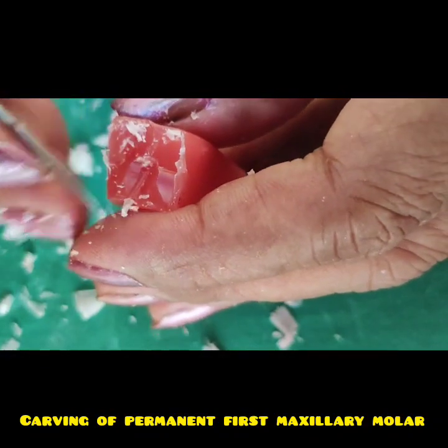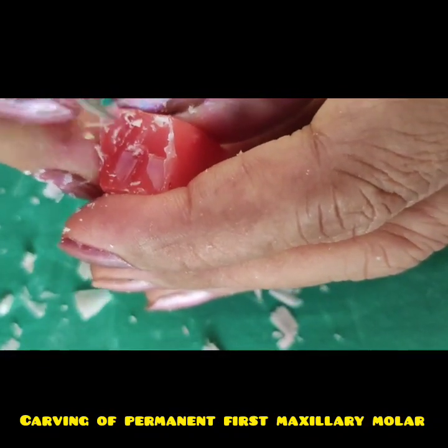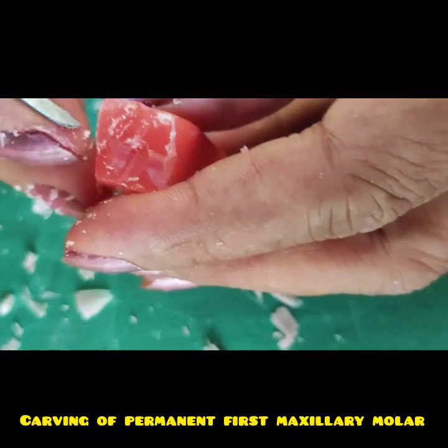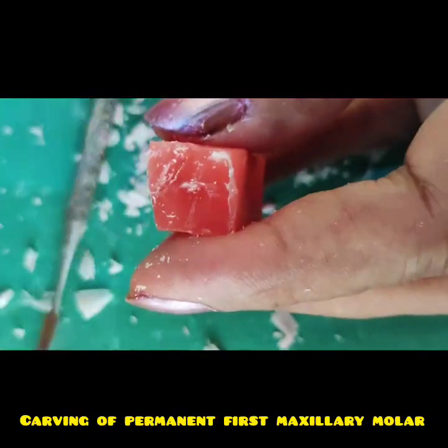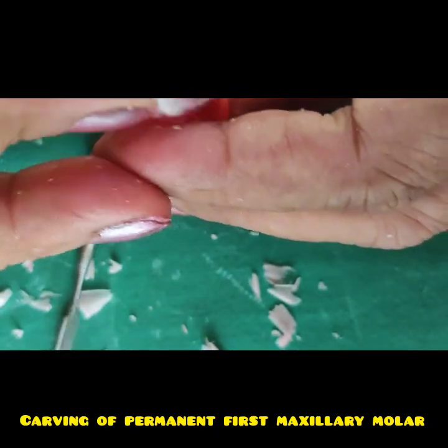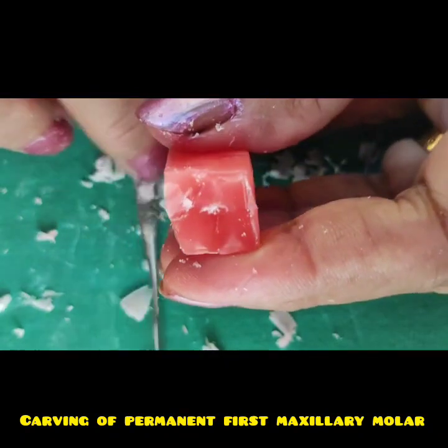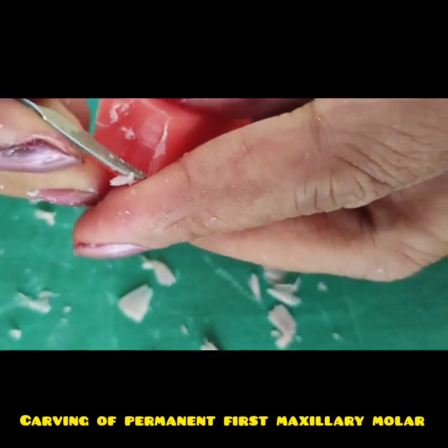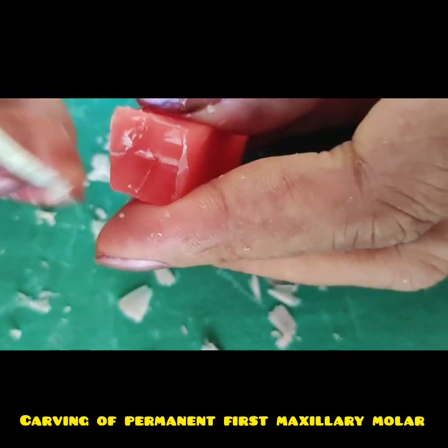So this is how the occlusal pattern roughly is seen. After polishing it will be more defined like this. So define the cuspal ridges more.